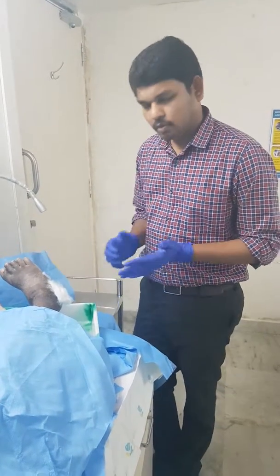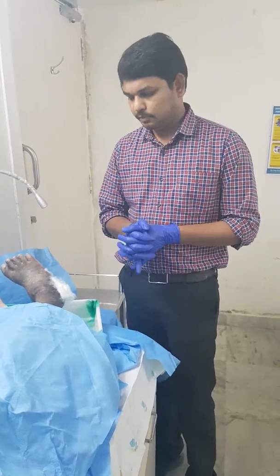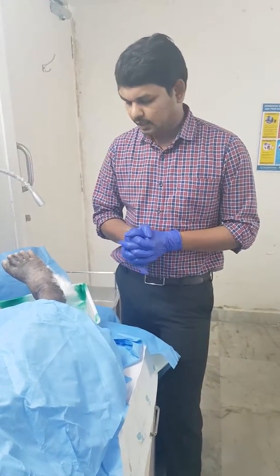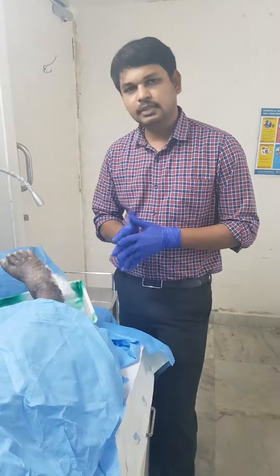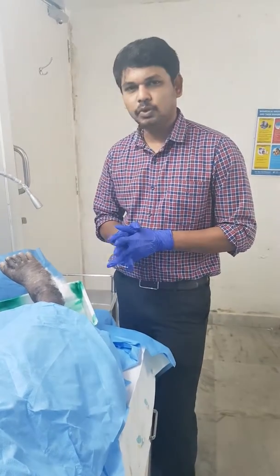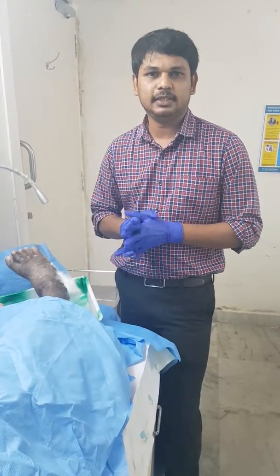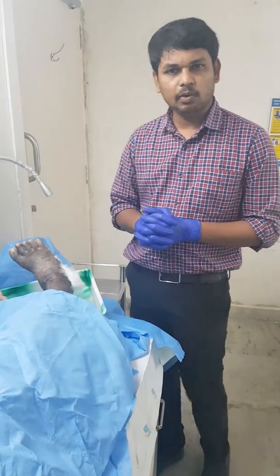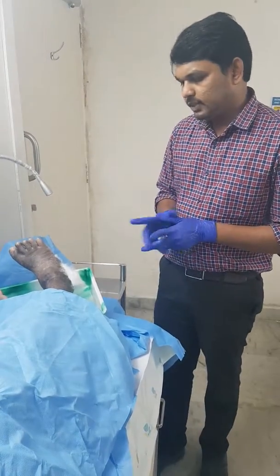Hello everyone. I have put many videos and spoken about how to do a proper dressing. This video is something different — I am going to show you what you should NOT do in a dressing. We have a patient who had a dressing done outside, and I am going to show you the problems with this dressing.